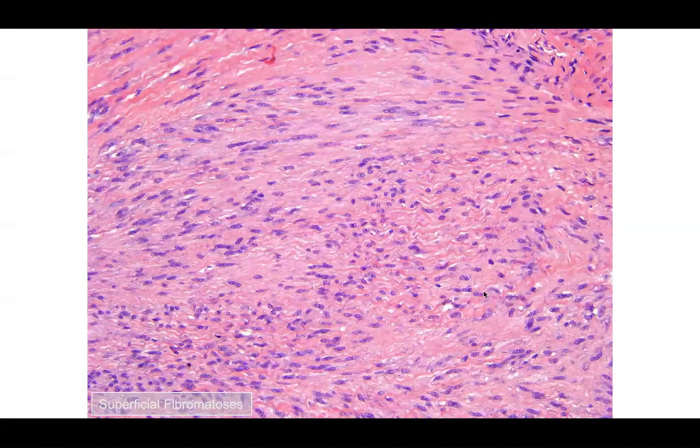Now, this is an even better picture because it shows you this kind of rippling, wavy architecture among the collagen bundles, or within the collagen bundles. And so I like this picture because it really gives you that sense that not only is the rippling and the waving happening with the collagen, it's also happening with the cells. And so if you see something like this, you should definitely be thinking about a fibromatosis.